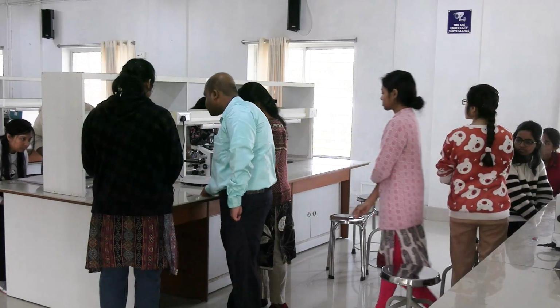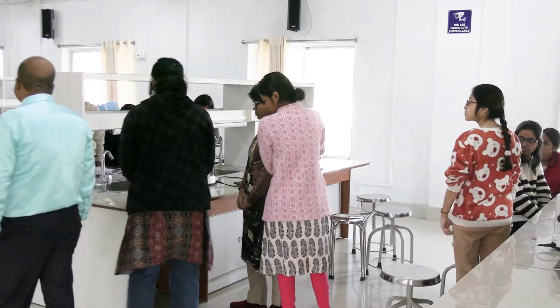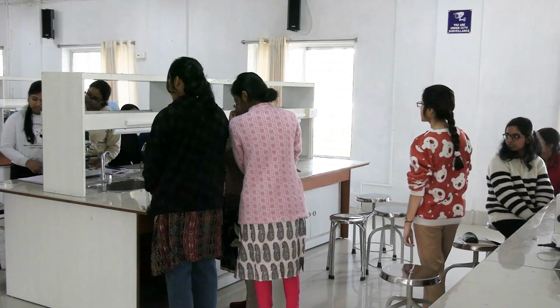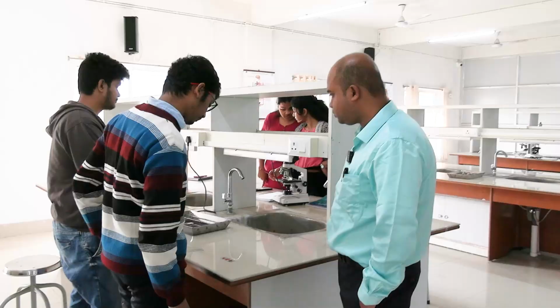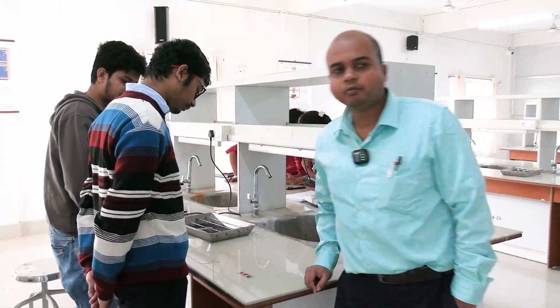This blood sample, that is not called coagulation. This is another common mistake. This is called agglutination. Coagulation is a completely separate thing. Don't utter coagulation along with blood group. Coagulation is blood clotting. This is not blood clotting. This is agglutination, clumping reaction. This is the same blood? Yes, sir. Okay, A positive.